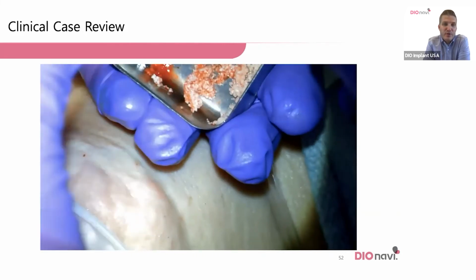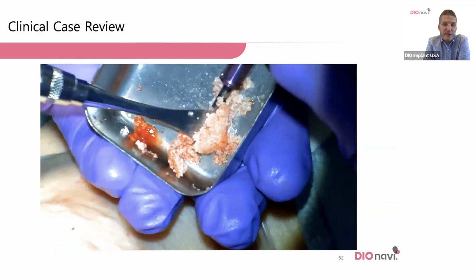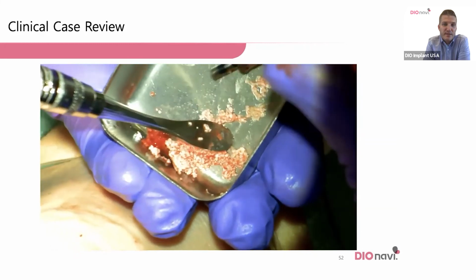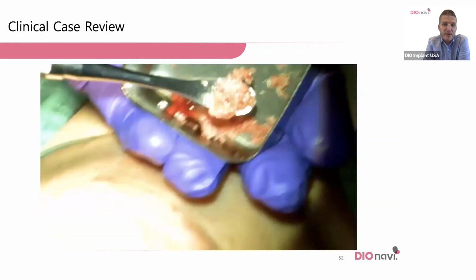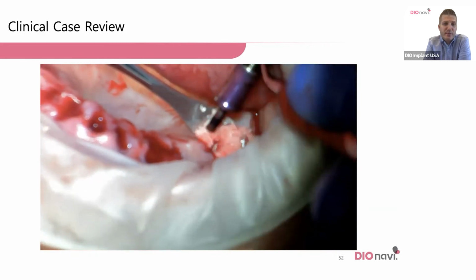A little bit more bone. Again, I didn't want to edit anything out. I wanted you to see this whole thing in real time, and so this gets a little repetitive here. But we're going to pack more bone. Isn't that sticky bone nice for handling?